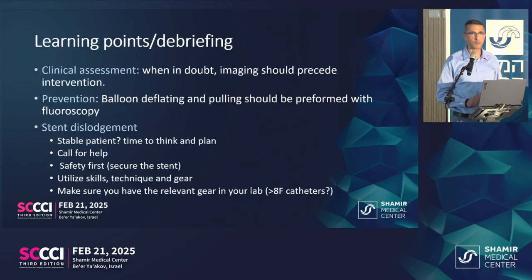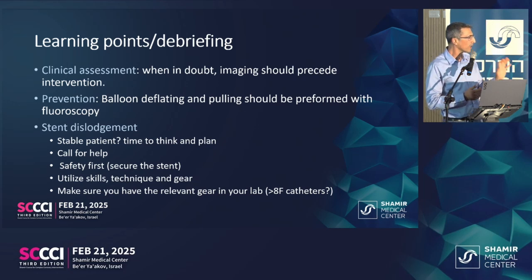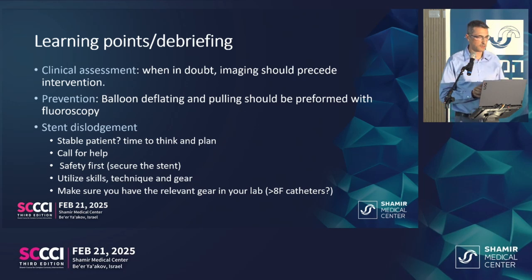So my learning points and my debriefing points, because we try to debrief each of our cases. First, the clinical assessment. I think that the most important part was, when in doubt before stenting, imaging should precede intervention, especially, and right off the bat, I think that every interventionalist in the room saw the angio and thought this is not a regular NSTEMI disease.